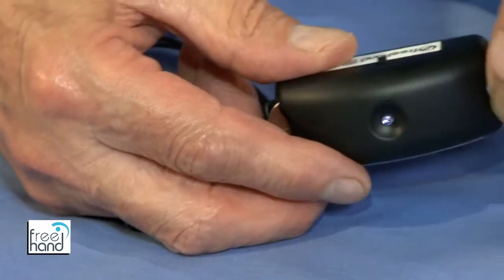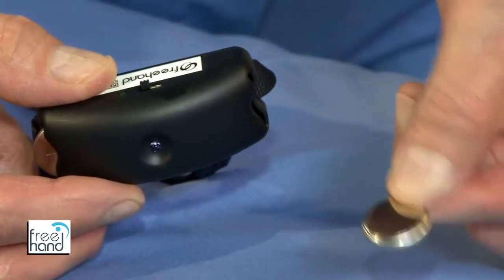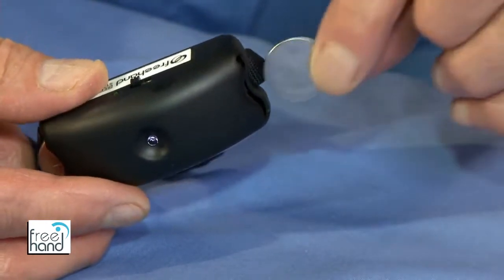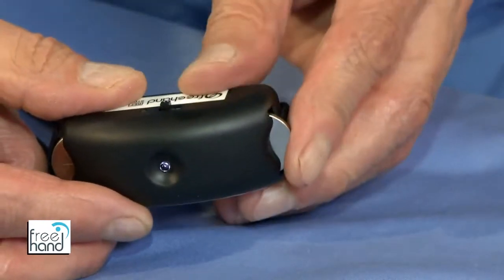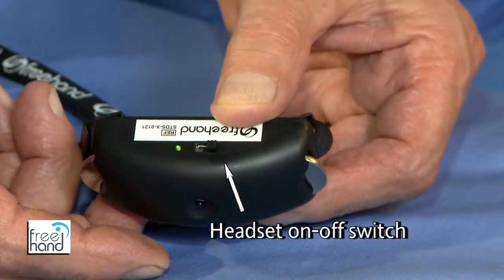and similarly, the engraved side, replace gently. Switch on, and it's working.